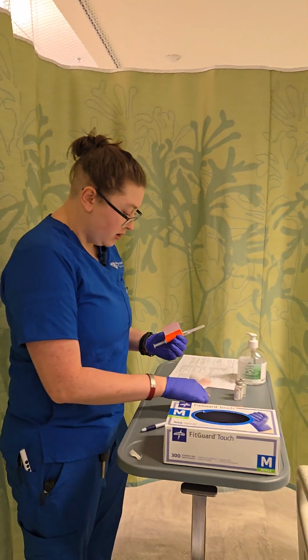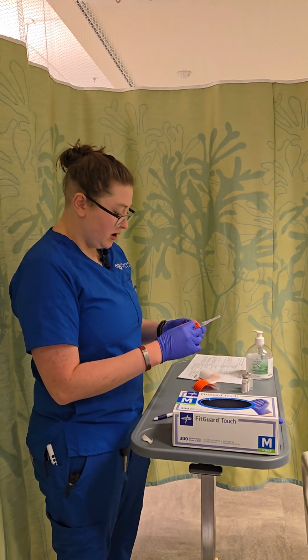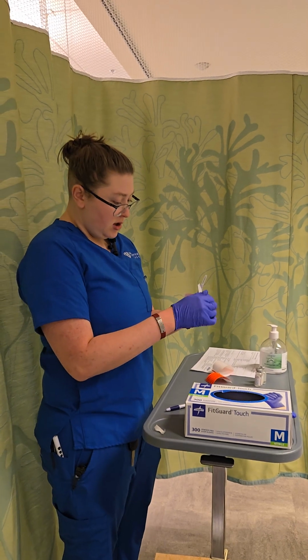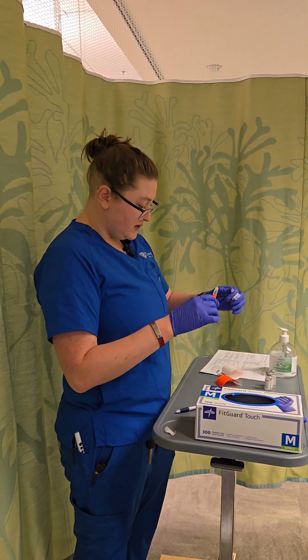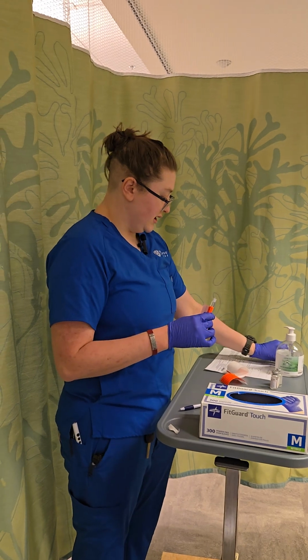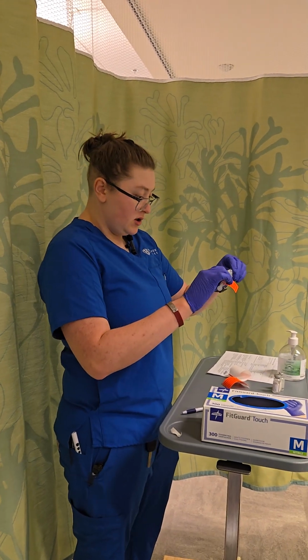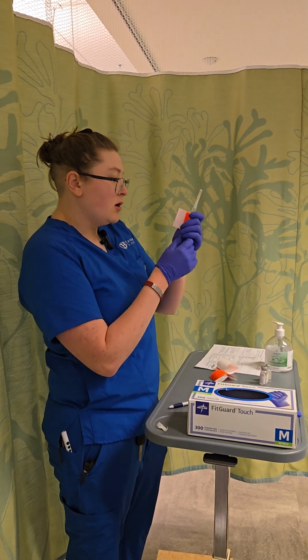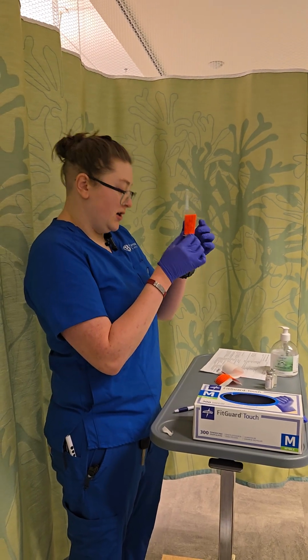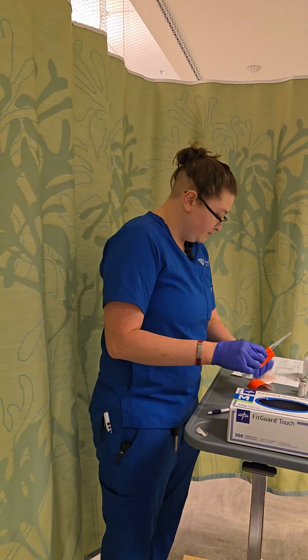It does have a blunt needle on it right now, and I'm not going to inject with a blunt needle, obviously. So I'm going to open this package. I'm going to undo this blunt needle. This blunt needle immediately goes into the sharps, and this new needle, this IM needle, goes on. Cool, and it is correctly filled.